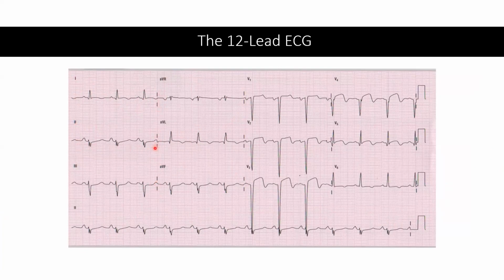So these marks over here should not be misinterpreted as pacemaker spikes. I used not to discuss this, and then I found out that students were misinterpreting them as pacing spikes. These are not pacing spikes. These are merely the dividing lines that separate one lead from another. Okay?